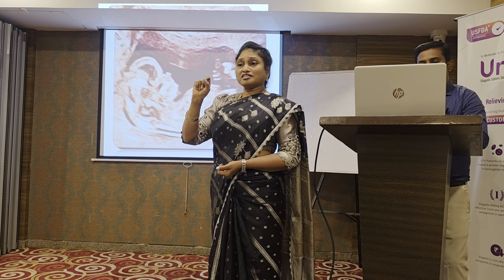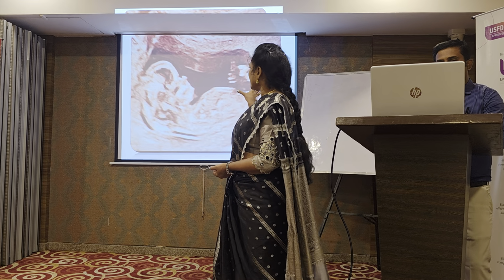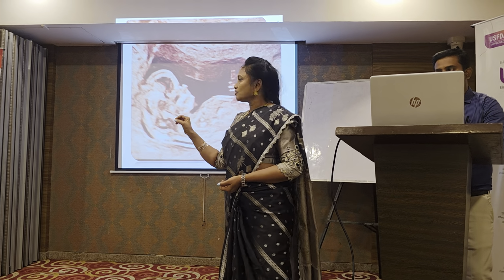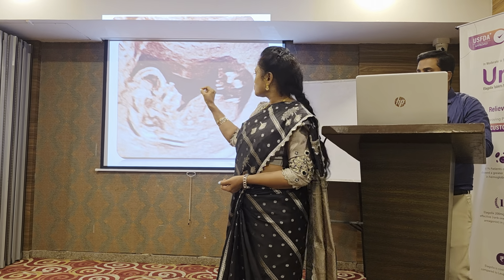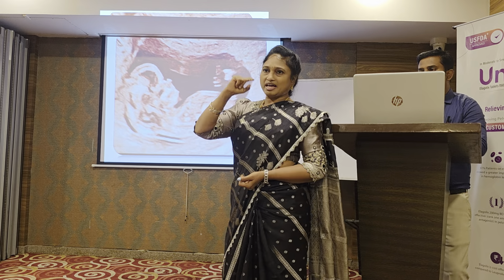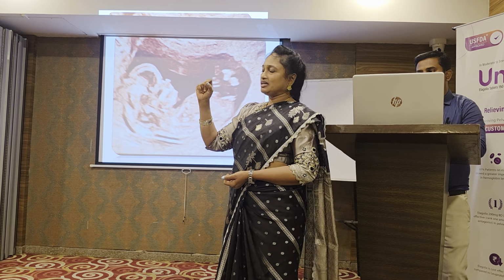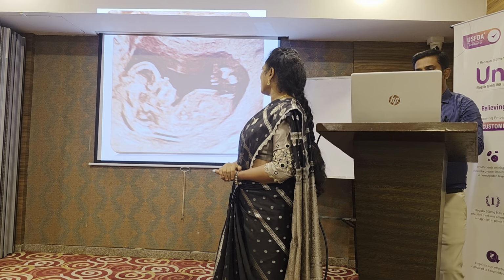Quite difficult when it's a baby which is moving very fast. It's difficult to get this section exactly, but you have to try and get it. In the same section you can see the ICT, intracranial translucency, as well as the nuchal translucency, and in the same section you can see the maxilla, that is the palate and the vomer. So you can rule out a cleft, posterior cleft or anterior cleft also.